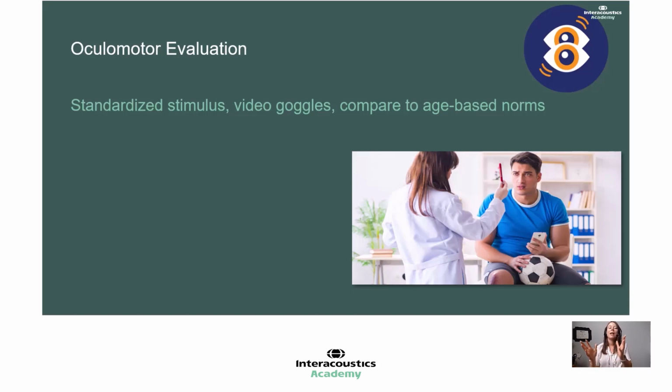In addition, I love being able to compare to age-based normative values. If I have a 55-year-old that comes into the clinic and says, oh, I didn't hit my head, but I'm also just getting older, so I know this is part of it. I can utilize my age-based norms to say, you know what? I know you said you're getting older, but there's actually, you're performing lower than what I would expect for your age.